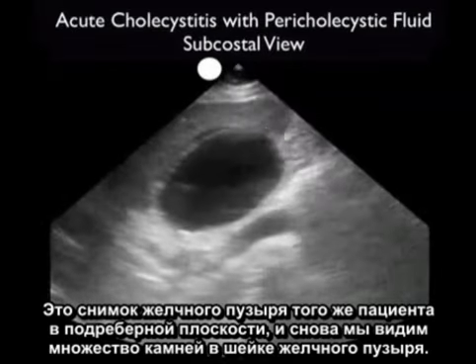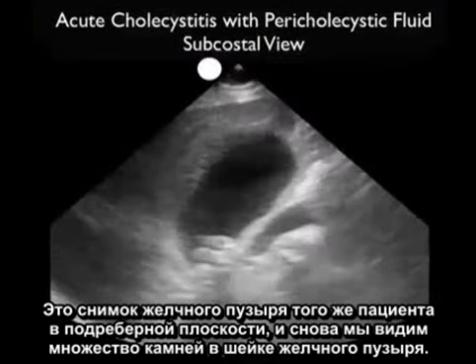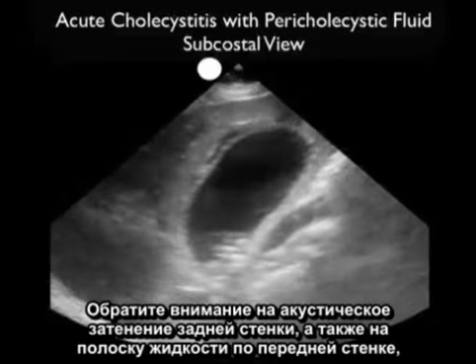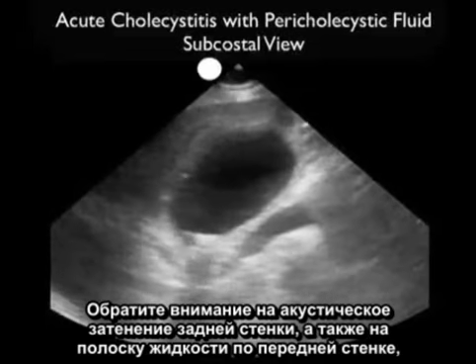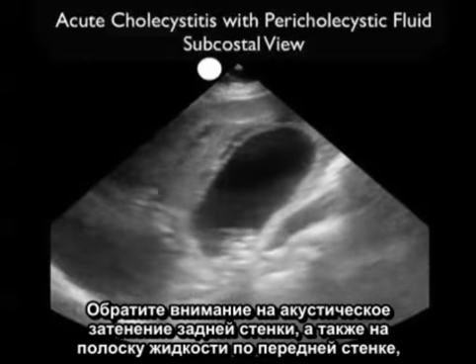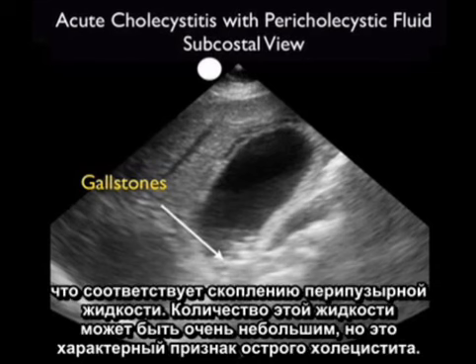Here we're looking at that same gallbladder from a subcostal view, and again we can appreciate the large concretion of gallstones present within the neck of the gallbladder, and note the posterior acoustic shadowing. We can also see that stripe of fluid surrounding the anterior wall consistent with pericholecystic fluid. And sometimes that amount of pericholecystic fluid can be subtle, but that's a significant finding for acute cholecystitis.